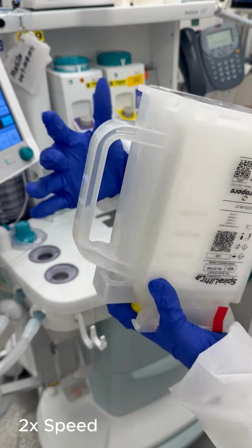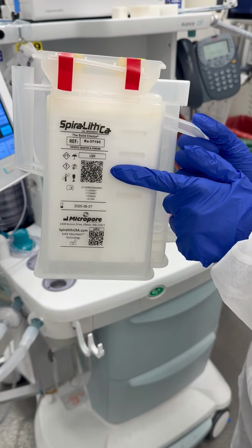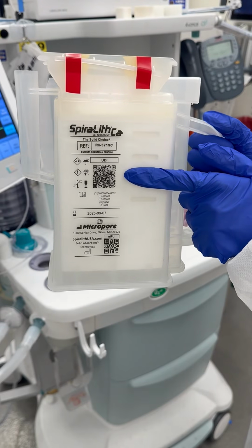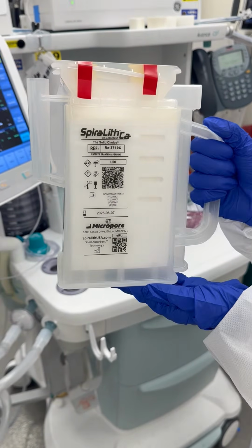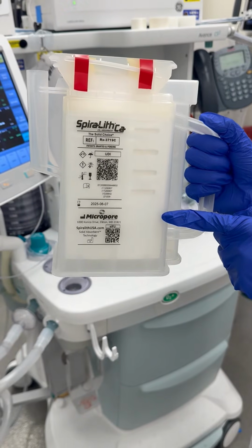Look at both top and bottom areas. There is a QR label on the absorbent that will direct you to the SpiraLith website, which has more information about the product. Here are the indicator windows which help you to anticipate end of cartridge life.